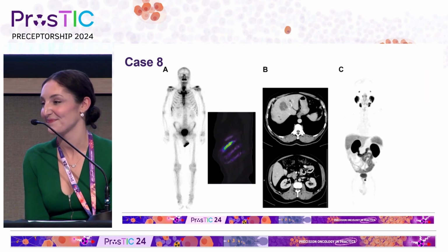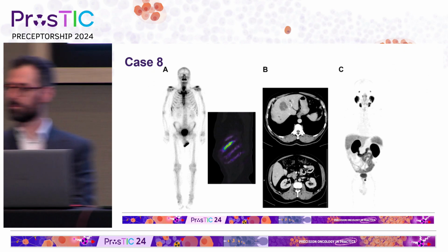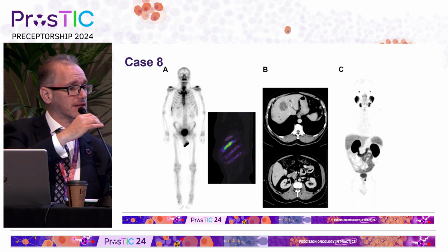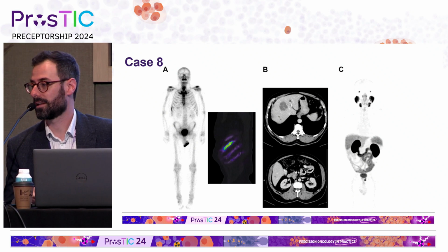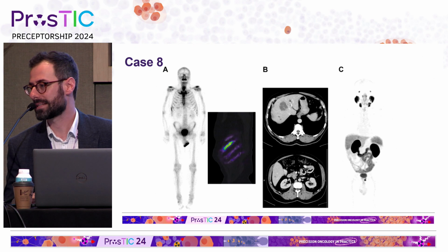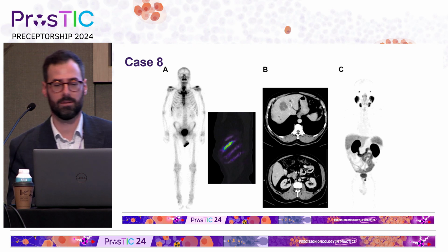Yeah, I think we did do a PSMA PET. Actually, they were in the pro-PSMA trial, so they crossed over as part of the trial to the other arm and had a PSMA PET. James, do you want to tell us the findings? Yes, we only have this screenshot. Highly avid focus in the left peripheral zone of the prostate. There are no nodal metastases, and there's absolutely no uptake in the bone. So that right rib and the liver lesions were completely normal on the PSMA PET scan.